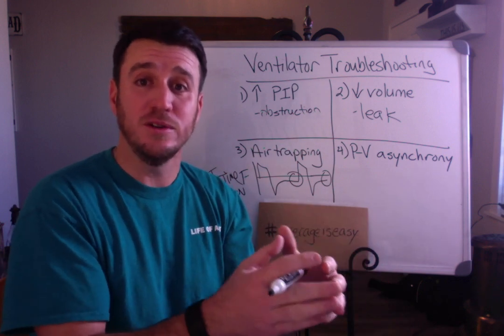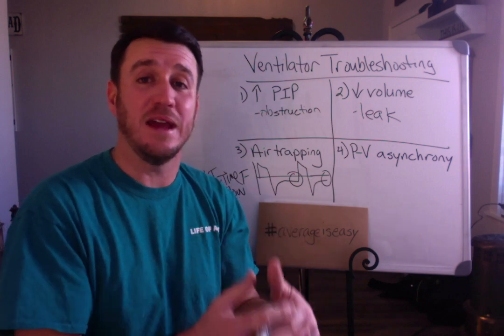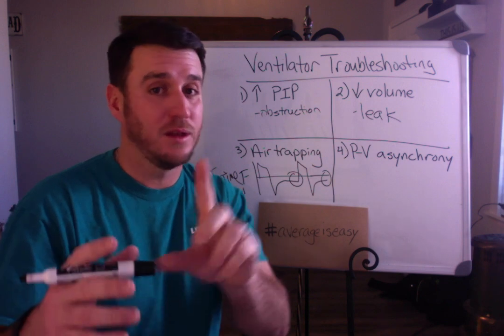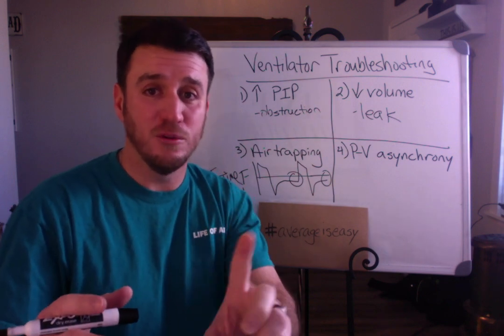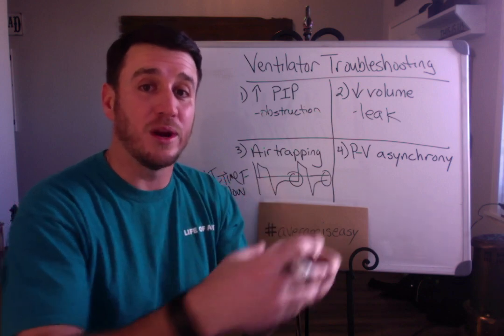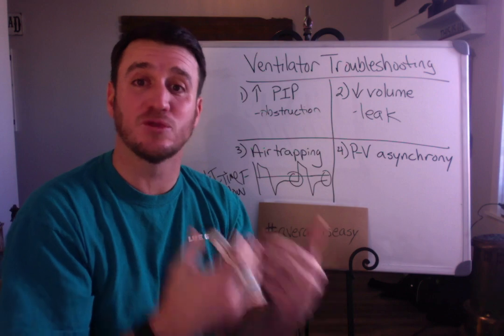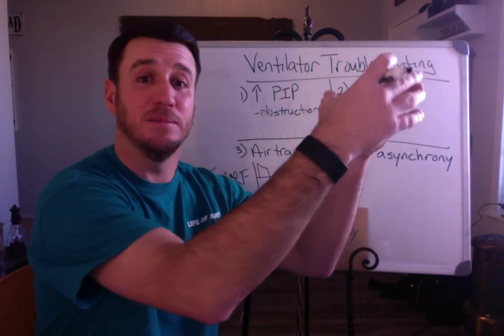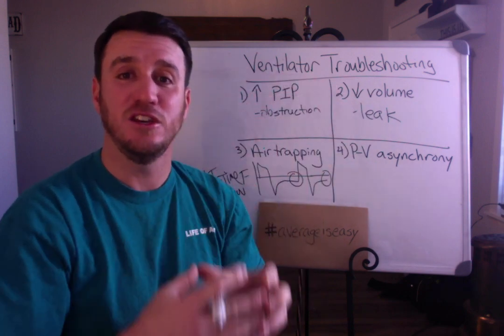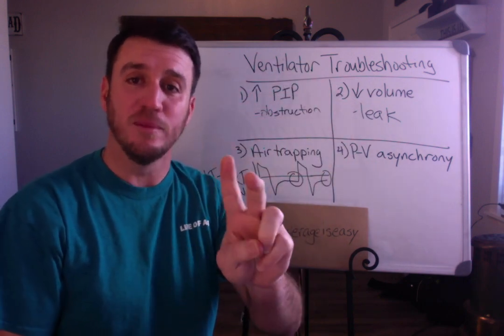What you want to do as a respiratory therapist is identify how to make the patient breathe like the human. I'm going to say it again. Too many times we try to make the human breathe like the machine. But in reality, as respiratory therapists, we need to make the machine, the ventilator, breathe like the human. Okay? This is going to show up in one to two of the most common ways.